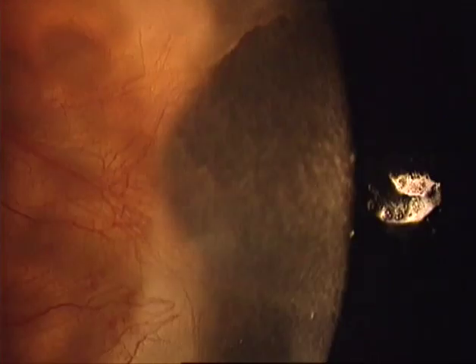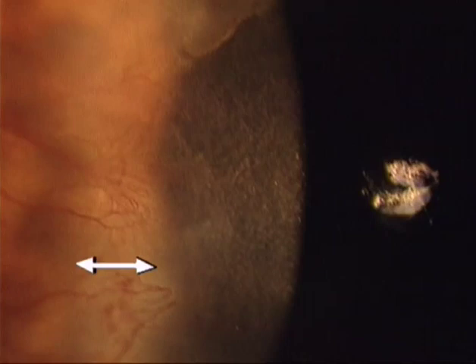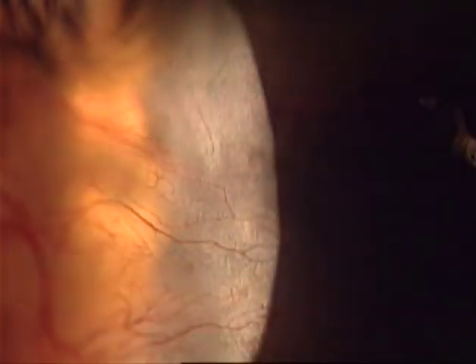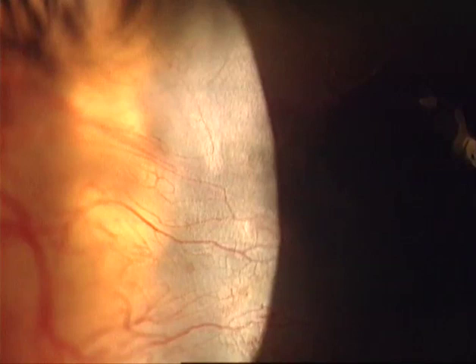At higher magnification, we see that in the zone of overlap, the deeply buried vessels disappear behind the haze of scattered light from the superficial layers of the cornea. On the other hand, the scattered light of the scar disappears due to irradiation from the background. Note, the negative effects of interference cannot be eliminated by increasing the brightness of the light, because this, to the contrary, just accentuates the blurring effects.